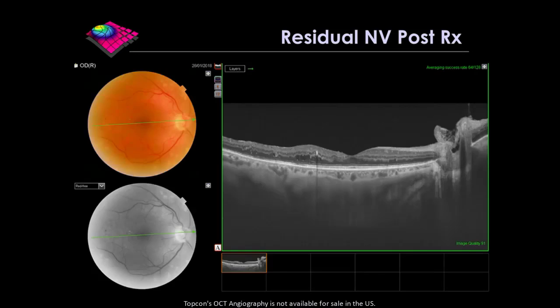And so what did we do with this patient? Well, they had 5 anti-VEGF injections into both eyes, and they had a lot of panretinal photocoagulation to both eyes. And so when were they last seen? Well, she comes back into us November 2017.